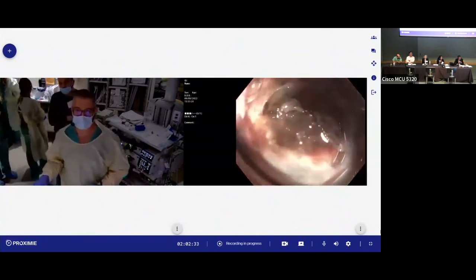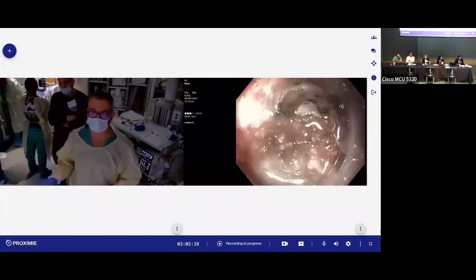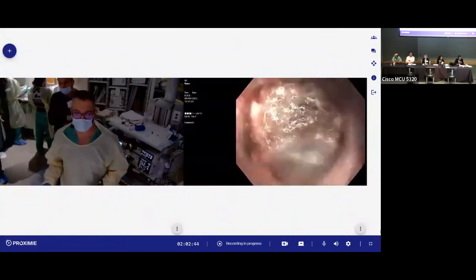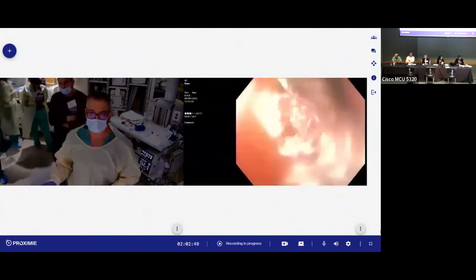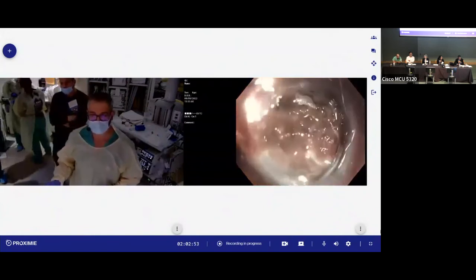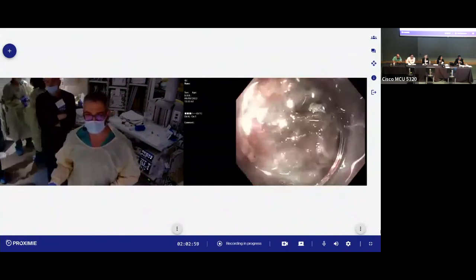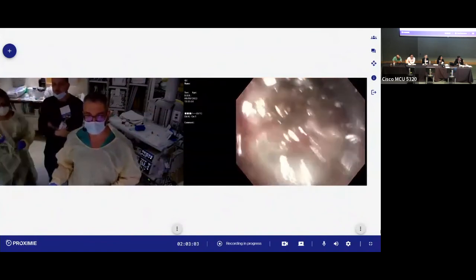So this is a very superficial cut, because this is EMR, not ESD. Up here, the muscle we're seeing is muscularis mucosa, and down here is the submucosa, the dense white fibers. So we had an injury on that side where I covered, and that's why I wanted to cover that part first. But here I feel like I don't see. Do you see, Sachin, something that you would like to tell me about? Maybe, no. I don't see a through and through defect either.